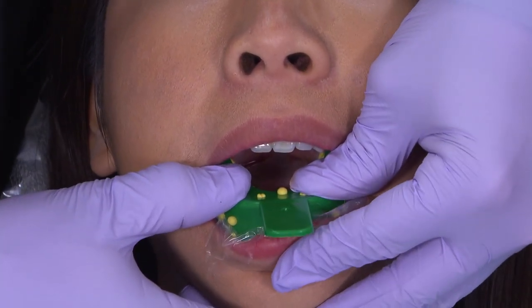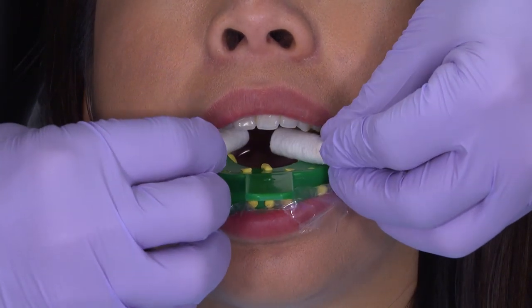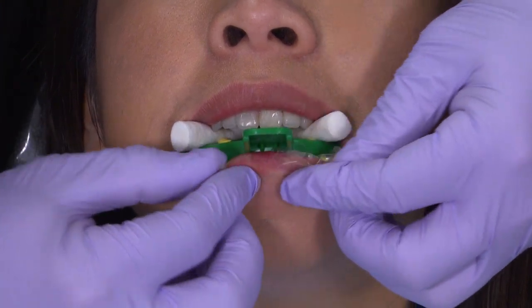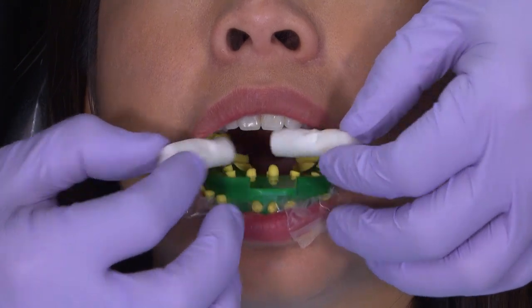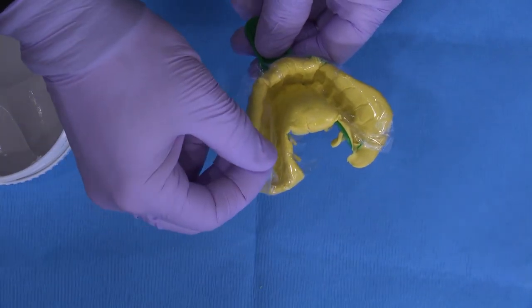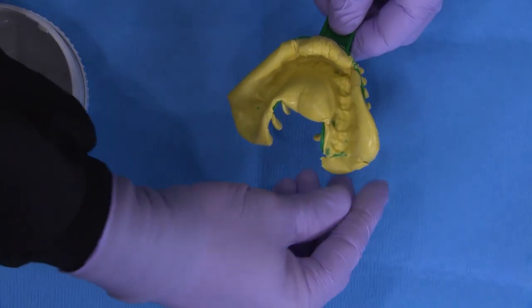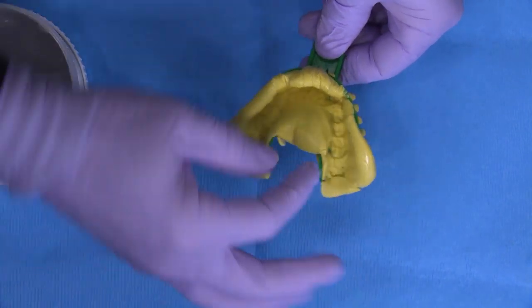Place the entire assembly in the mouth and seat it into place first with hand pressure. Next, place two cotton rolls bilaterally at the bicuspid area and ask the patient to bite into them firmly. Manipulation of the lip can aid in the formation of this putty tray. Then after 5 seconds of firm pressure, remove that tray from the patient's mouth. While the putty is still pretty soft, take off that plastic sheet.